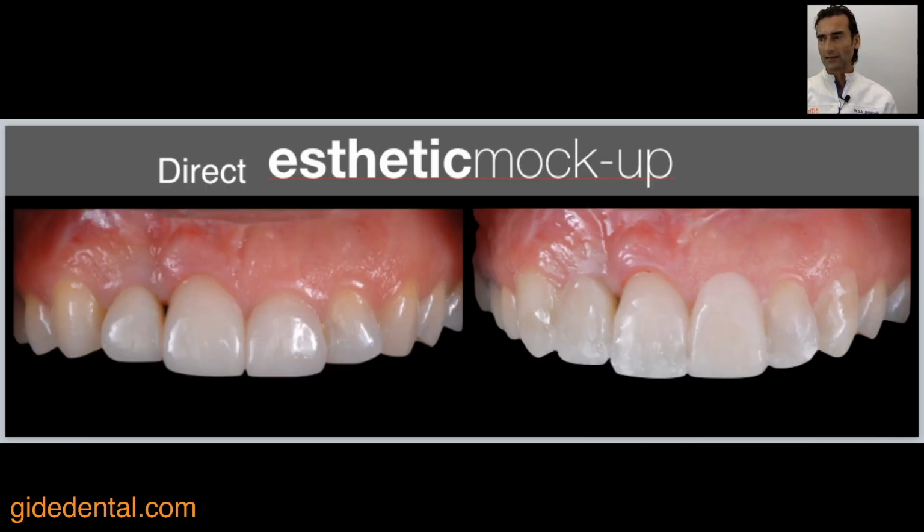Looking at the aesthetic mock-up, this is what we did for the patient, so the patient understood what could be done for her. Notice here how we lengthened the tooth number 9, so it would come to a normal cervical margin. We didn't do too much to the cervical part or the gingival part of tooth number 8, but we lengthened both number 8 and 9 by 1 millimeter. So you can see that this already gives the patient a much better functional and aesthetic comparison, especially when we look at the lateral incisors.